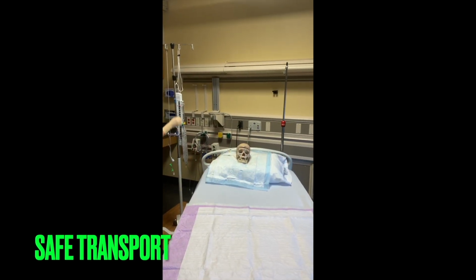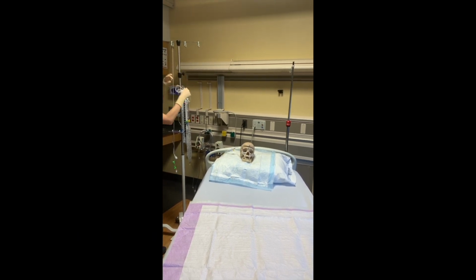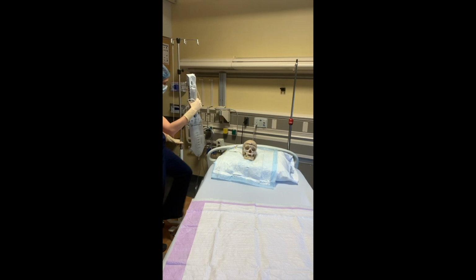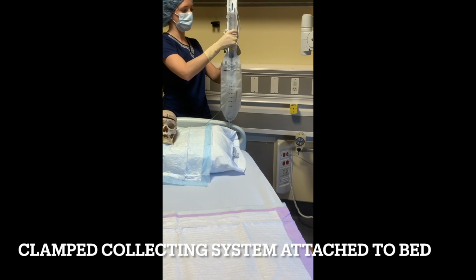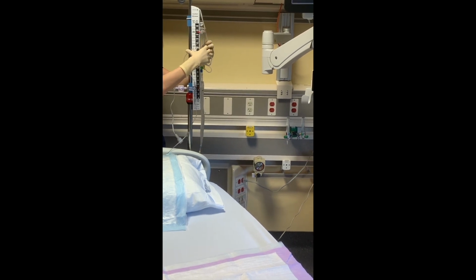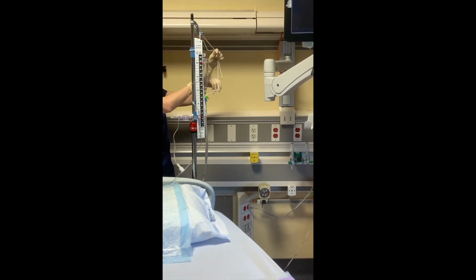In this video, you'll notice the first thing that's done is the EVD is moved from the open position to the closed position prior to movement of the collecting system relative to the patient. The collecting system is taken off of the IV pole and placed onto the patient's bed, clamped temporarily, and then leveled at the patient's external auditory meatus. The entire time that the collecting system is moved, it is closed to the patient, therefore not allowing the unsafe drainage or over drainage of the patient.